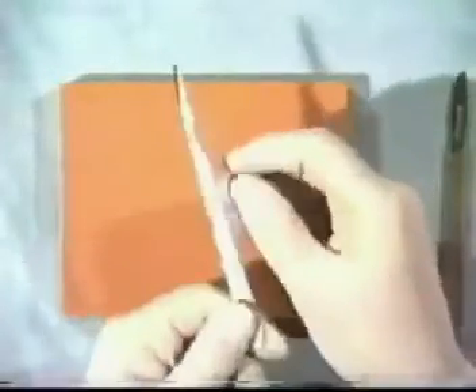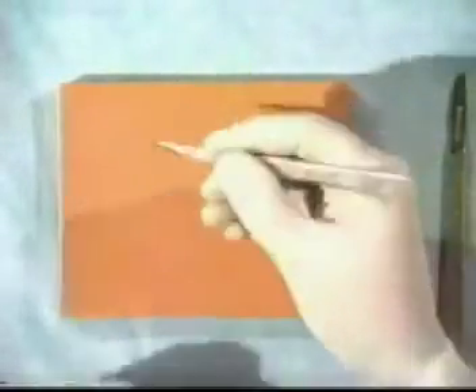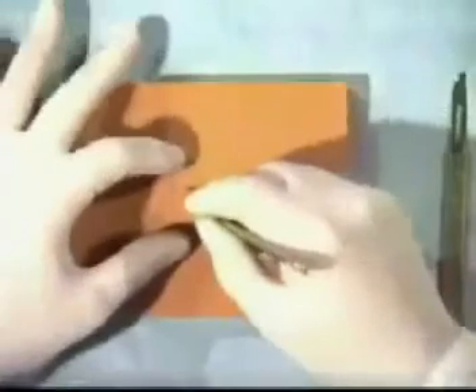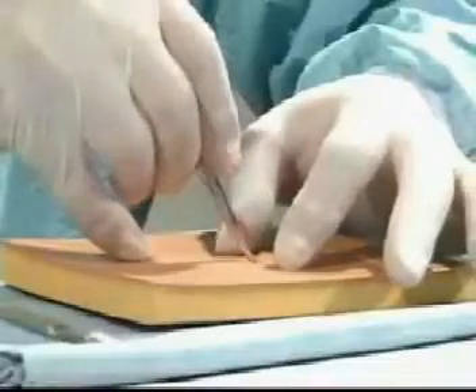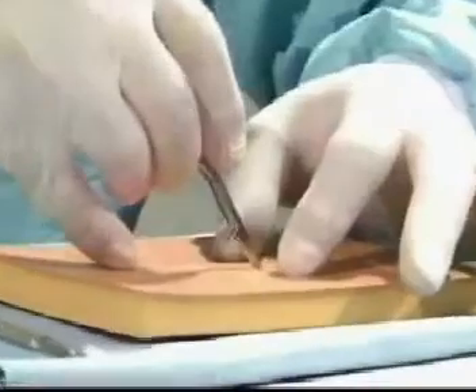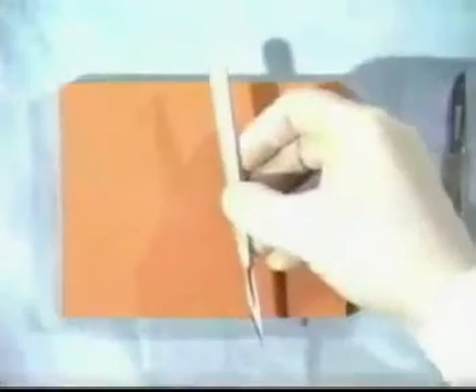When doing delicate work with a fine-bladed scalpel, you may wish to hold it like a pen so that finer work can be undertaken. Note how the little finger can be used to steady the hand holding the scalpel. When passing a scalpel, never pass it blade first — always pass it handle first with the blade down.